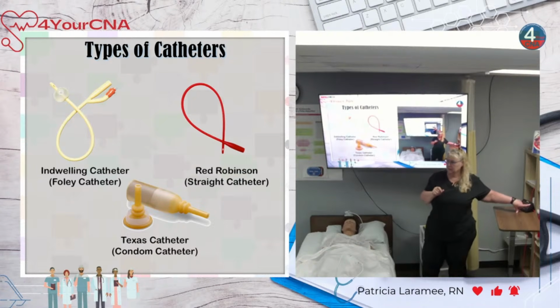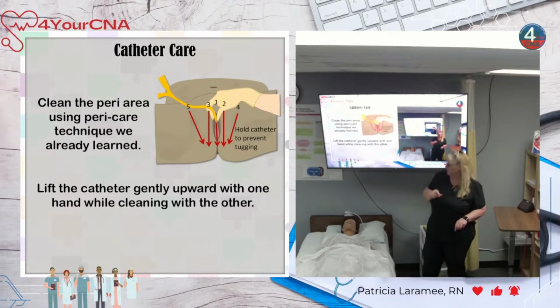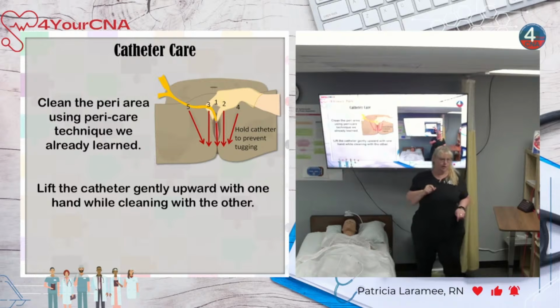Good? And then you have this special training to be able to change that one anyways. You would have to be trained on how to do that. So you guys all understand catheters? Don't hold them up. Don't let them touch the floor. If they fall out in any way, put them in a bag in the bathroom for the nurse to see and let the nurse know.